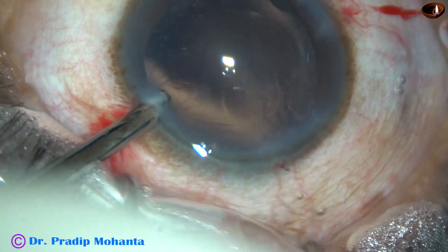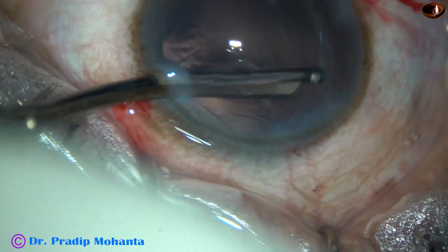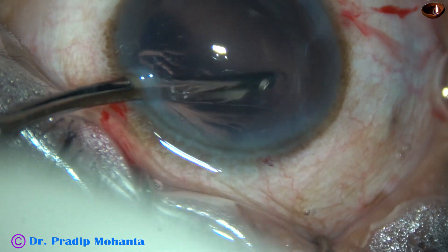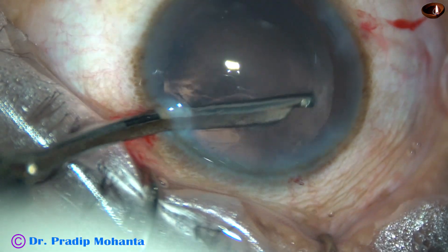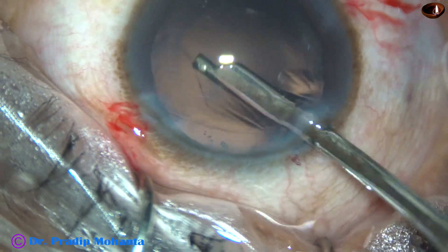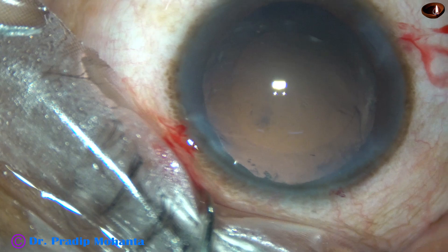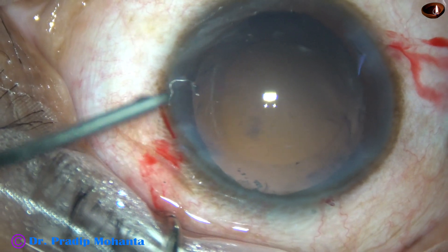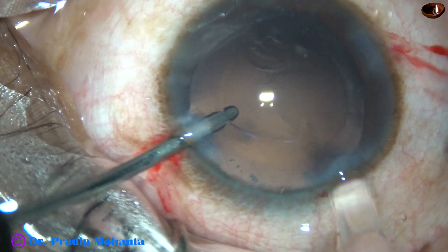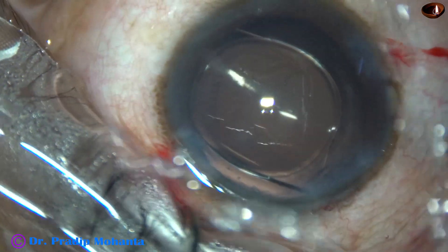Cortical cleanup is being done at this time. We can use bimanual irrigation-aspiration cannulas, but the Simcoe instrument works very well, and in many instances it is a safer instrument than bimanual irrigation-aspiration. Here the vacuum is in your hand — you can use zero vacuum, use reflux, or use high vacuum, just in a fraction of a second. But with the foot pedal it's not so quick, and that's why Simcoe is safer than bimanual irrigation-aspiration. However, bimanual irrigation-aspiration is also a good instrument.